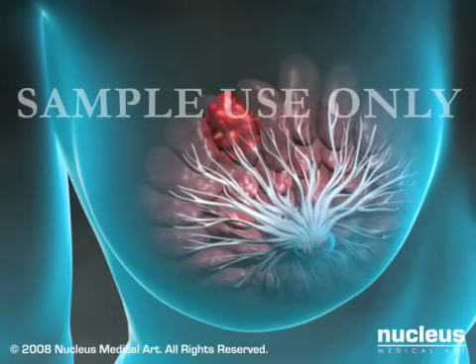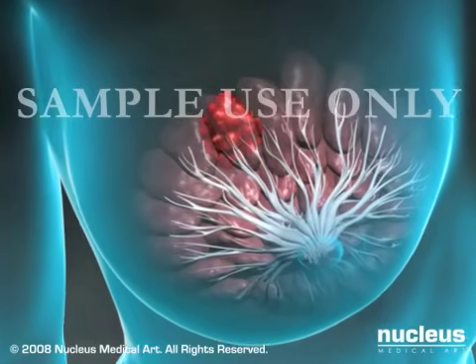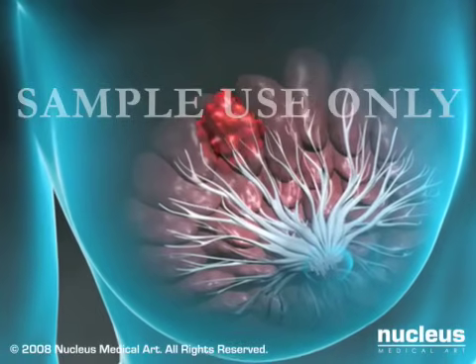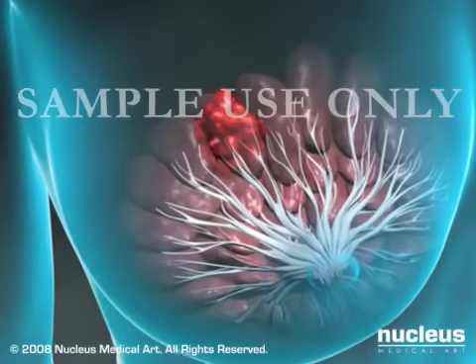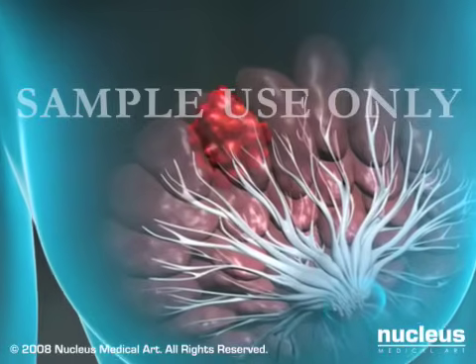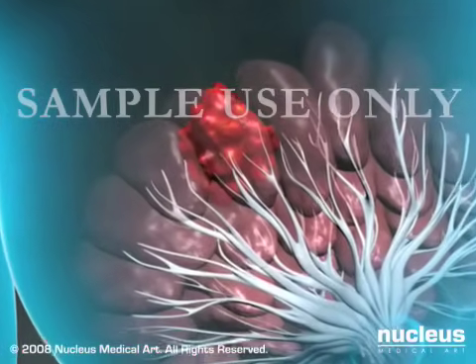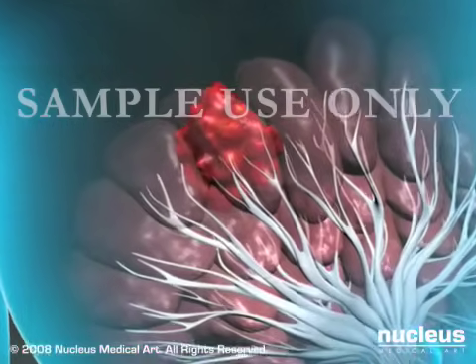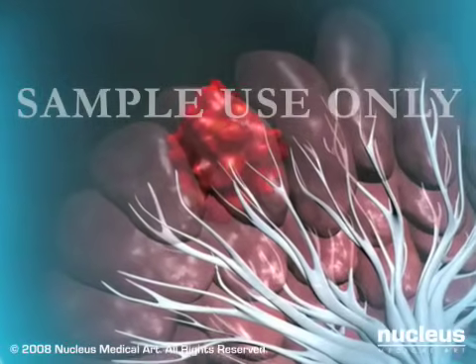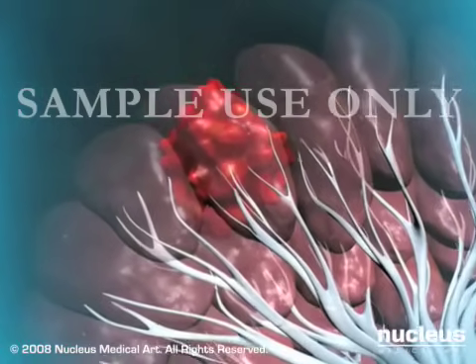Stereotactic and ultrasound-guided core biopsies involve removing a small sample of tissue with a needle. However, if a suspicious area detected by mammogram or ultrasound is not accessible by a core biopsy, or if your physician wants the entire area removed, he or she may recommend a surgical biopsy.